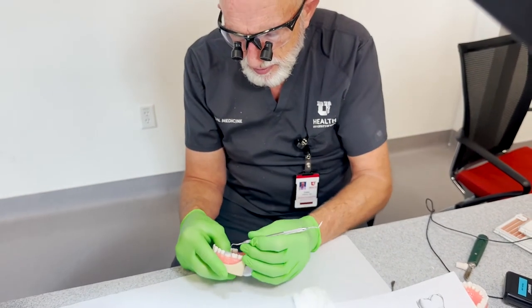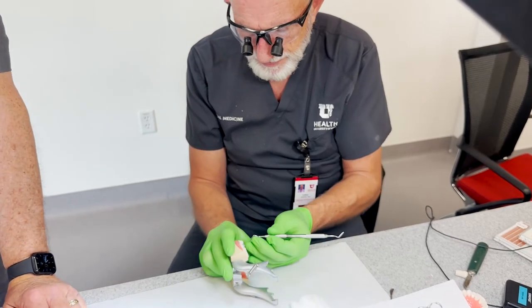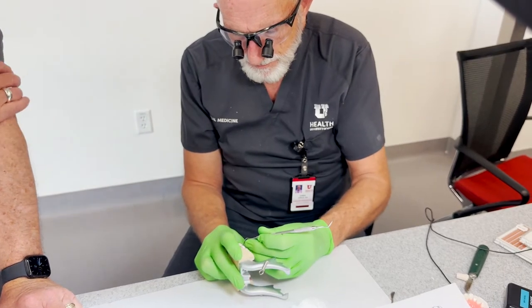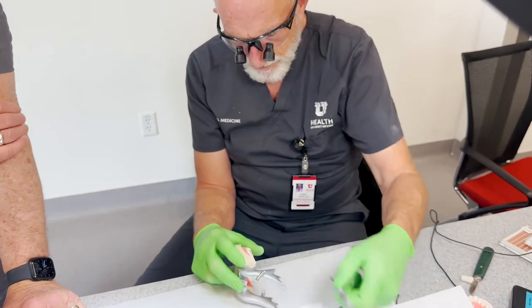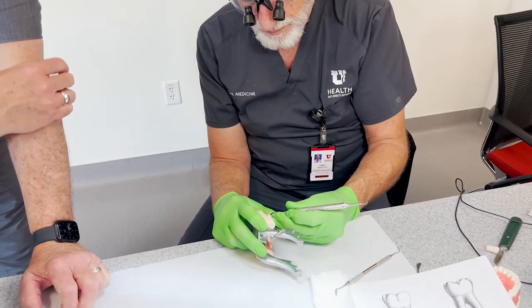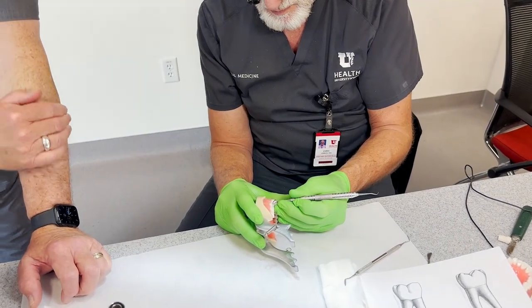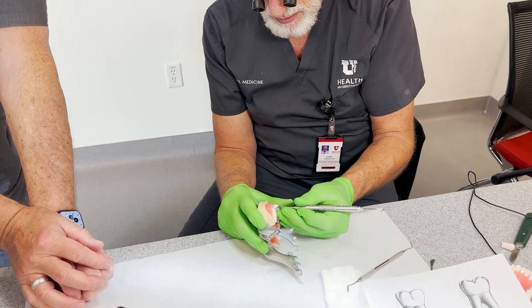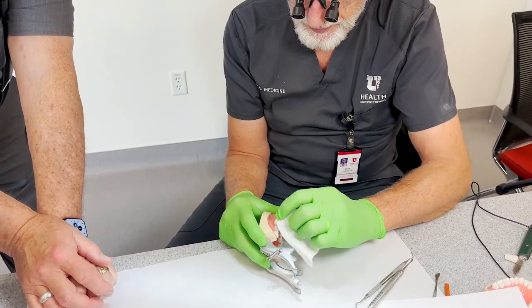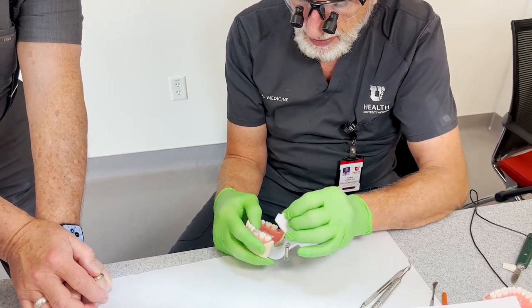The other thought that occurred to me in class was, these can all be designed digitally. And in fact, when I talked with the students in the other room, when they did their zirconium crowns, they actually digitally designed them and then milled them. Okay. So there'll come a day that we won't have to do any of this? I think so, sadly. Well, I think they still learn from this. Well, they do. Anatomy and stuff.